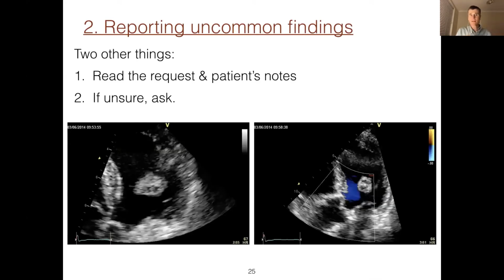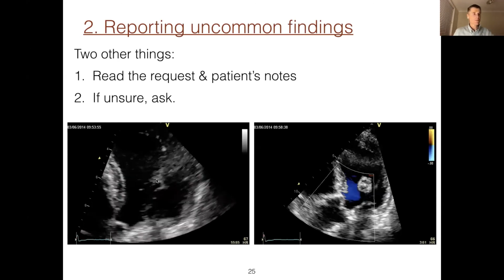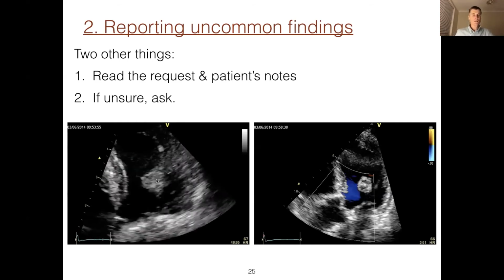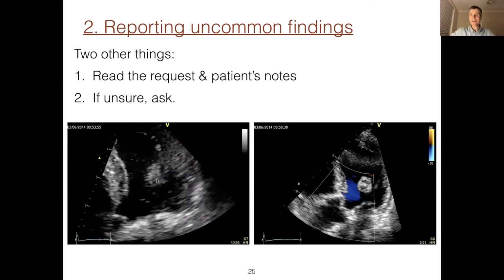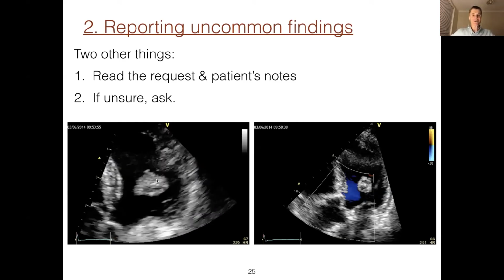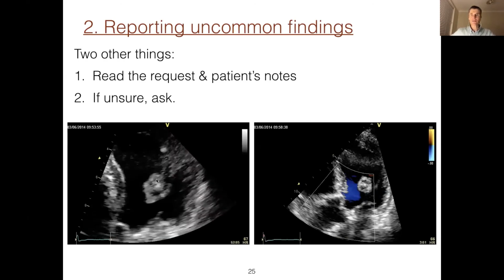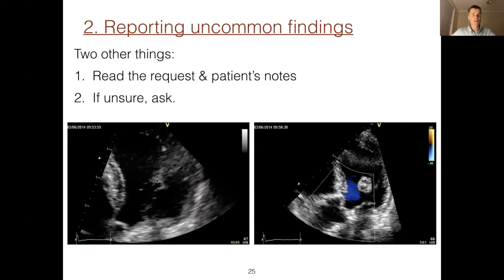A couple of other things. Again, like what we spoke about earlier on, if you see something and it's really jumping out at you, try as best you can to remain calm, like all the signs we're seeing at the moment about coronavirus, and try as best you can to just continue on with your sequence, especially if you're in a fairly stable setting.